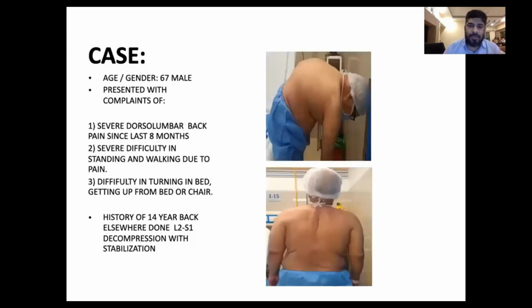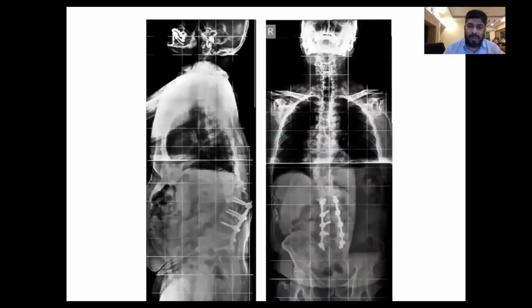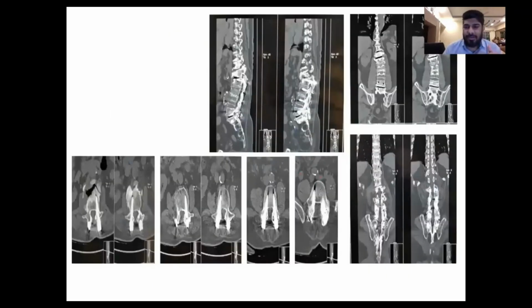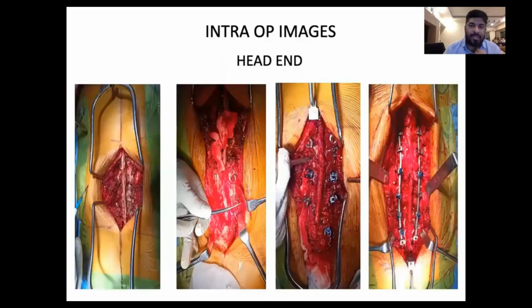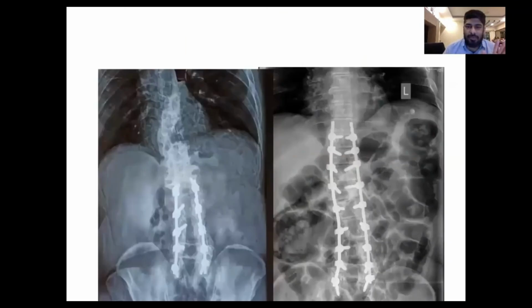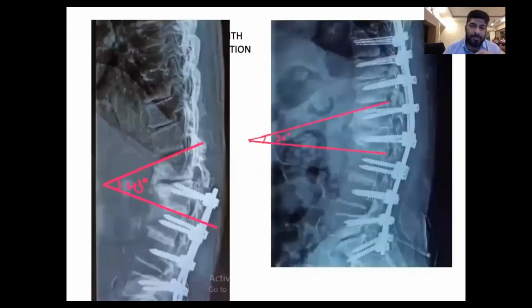This is a proximal junctional failure in a 67-year-old gentleman, badly painful, and he was crouched. We planned for advancement of fusion in this particular case. There was a deformity, degenerative scoliosis in this particular gentleman. The VAS was around 8, 9 on 10. We did around D10 to S1 revision. We got dual core screws, absolutely long length screws, and he's doing so fine so far.